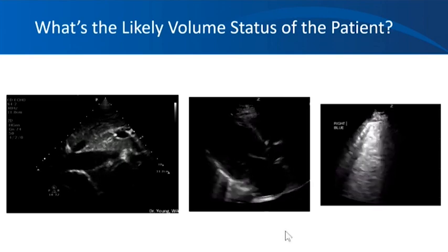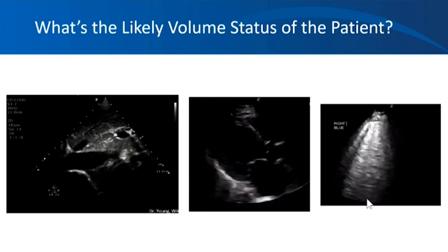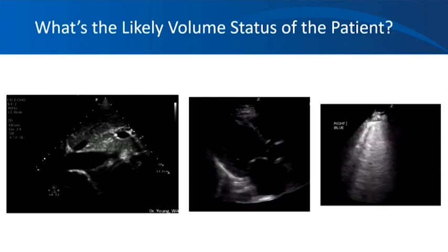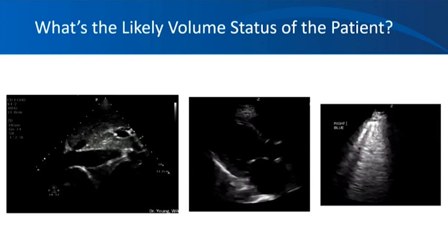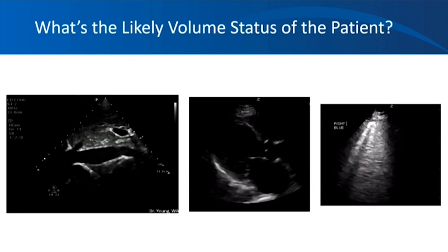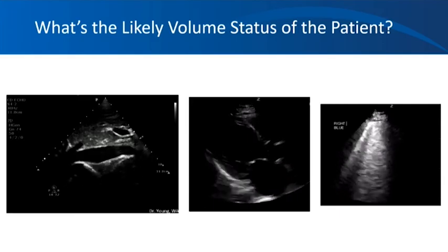systolic dysfunction. And here you see B lines, nice vertical lines extending from pleura to the bottom of the screen. Those are moving with respiration, which indicates fluid in the lung. So taken together, this suggests that the patient has severe congestive heart failure with pulmonary edema, and this patient would benefit from diuretic therapy or ultrafiltration. And that's all I got for now, and thank you.